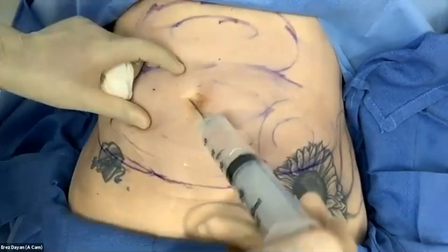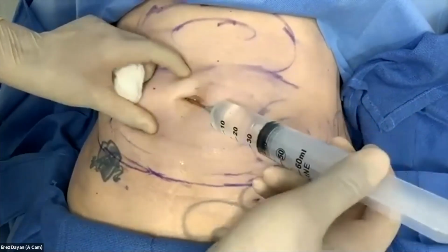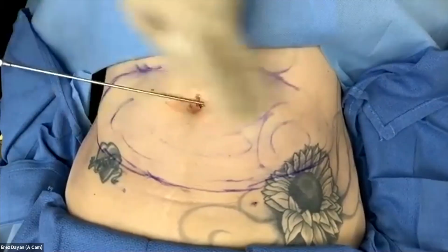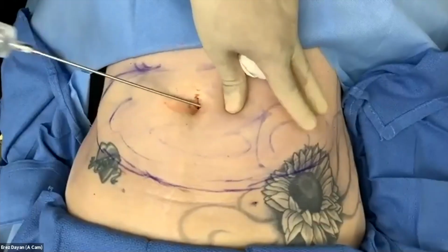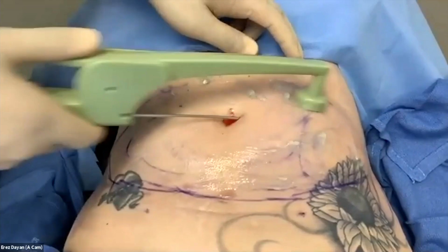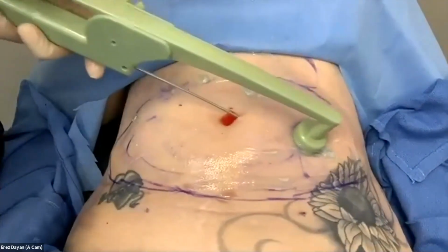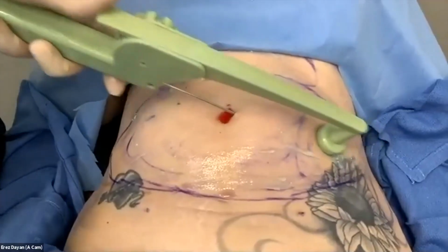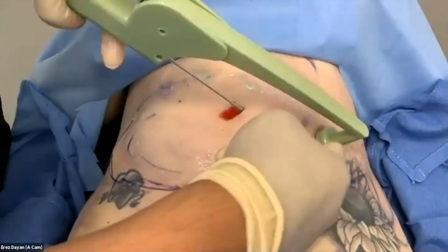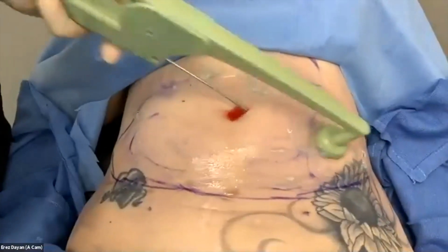And I'll just do the same thing on this side. You feel that there? A little bit. So here we go. I'm in the right plane here. As a plastic surgeon, I just have a tendency to prefer lipo RF just because I know how reliable it is. I just know how it's going to work out. So you guys see here, I'm cantilevering down like this. I'm not coming like that because it'll be superficial here. I'm just tightening these areas.